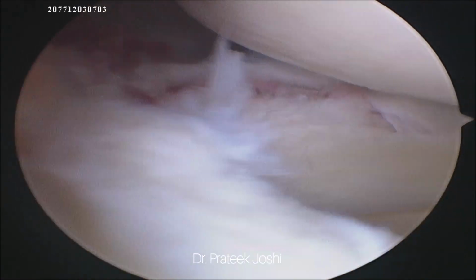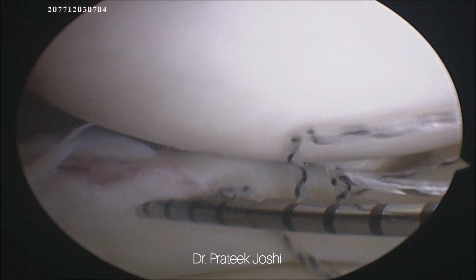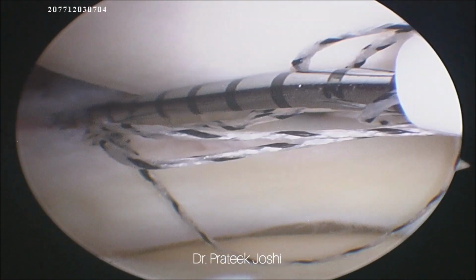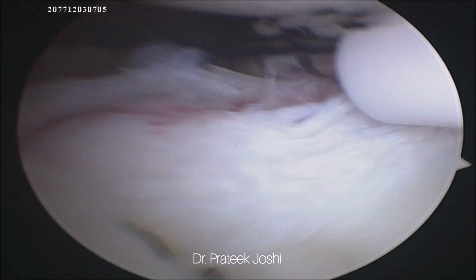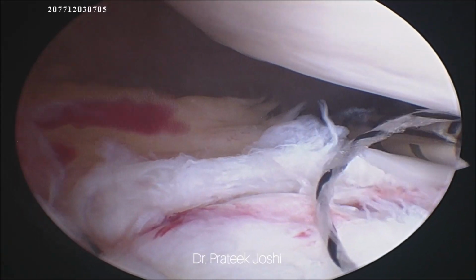So we are done with our first stitch, and now we are going to proceed towards another stitch which should be around half centimeter away from the first stitch. You can see I am trying to negotiate my all inside device superior to the meniscus, and once I pierce the posterior capsule, I am going to deploy my first implant.